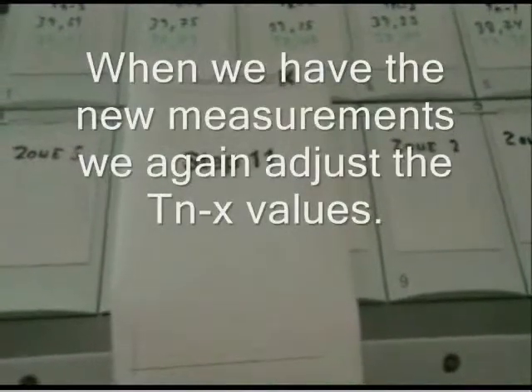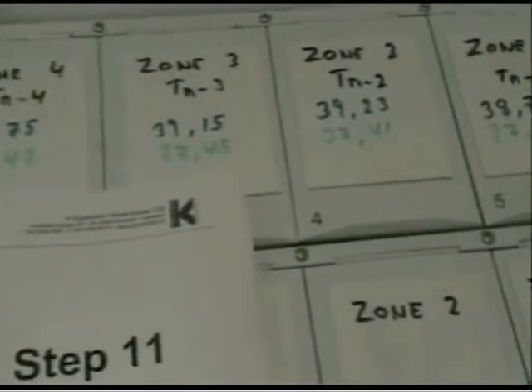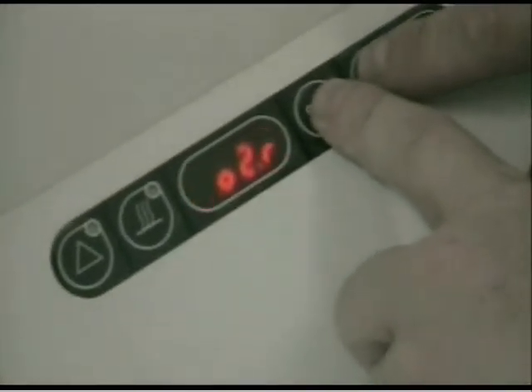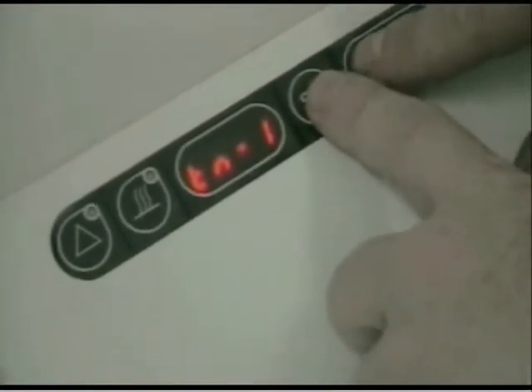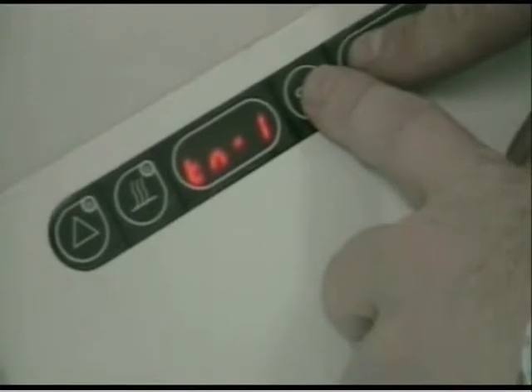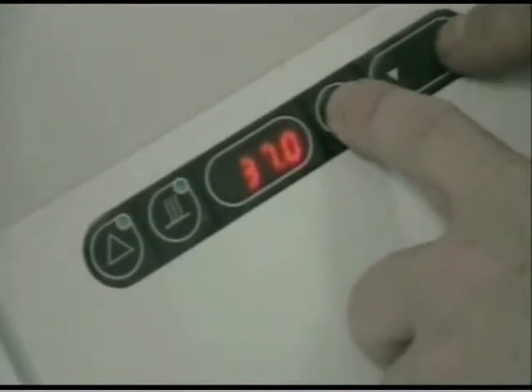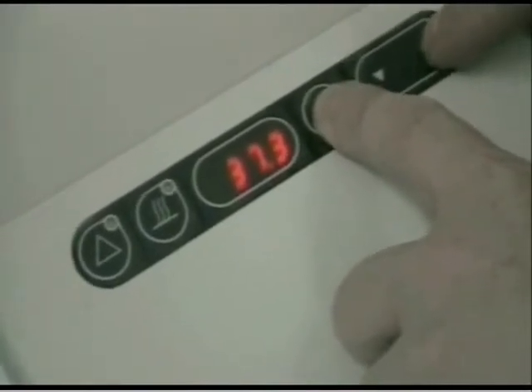Now we have our second series of measurements on the zones. We will now adjust the tune values like we did before inside the menu on the G185. I enter the menu and scroll down to tune 1. On zone 1, compartment 5 and 10, we have a measurement of 37.38, so we adjust the value to 37.4.